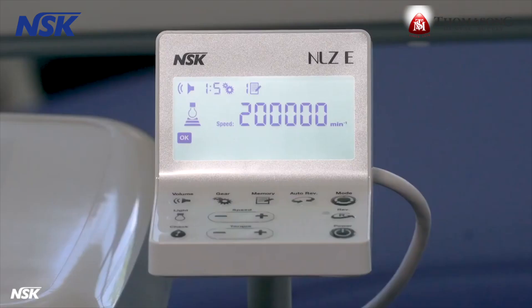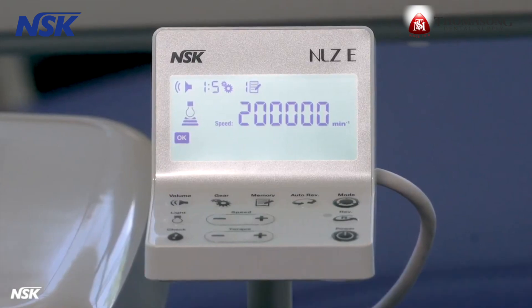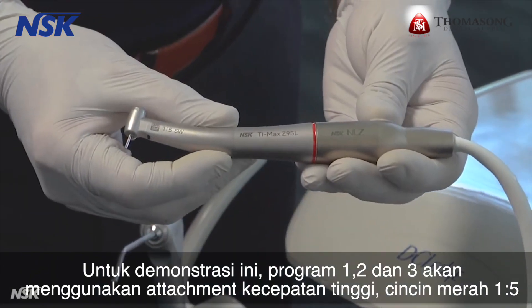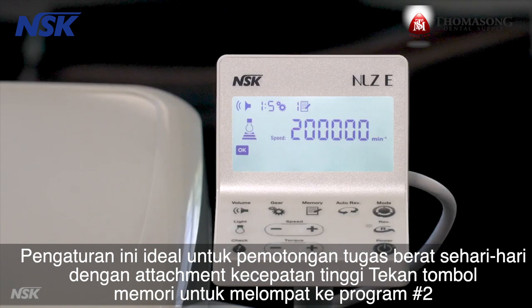Let's review the buttons on the touch panel and set up a few sample programs. For this demonstration, programs one, two, and three will use a high-speed attachment, red ring one to five. Out of the box, program number one is preset at a one-to-five gear ratio, 200,000 RPM. This setting is ideal for everyday heavy-duty cutting with a high-speed attachment.